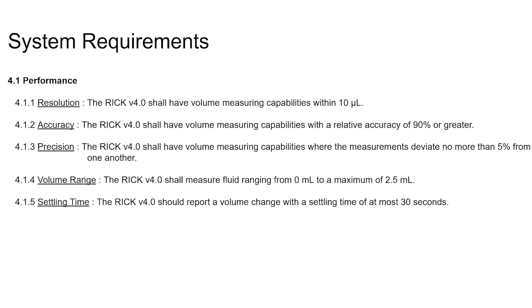Lastly, the settling time we created to be about 30 seconds. However, during our testing, we found out that that might be too small, considering some tests can run up to 16 hours within the Benchmark Ultra.